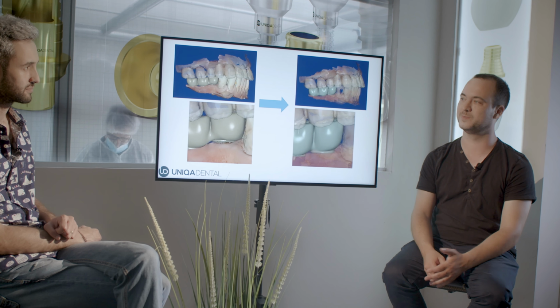It takes a lot of time. You don't know exactly what the occlusion will be. You need to have some learning curve. You need to have more information that goes between the doctor and the technician, and how you transfer this information from the technician back to the doctor.